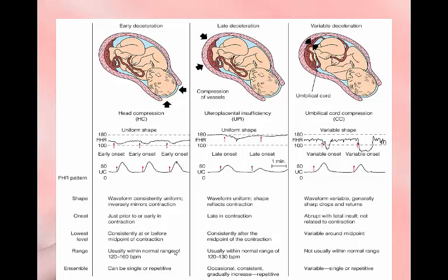Like I said, early decelerations are caused because of head compression. They are not worrisome. Okay, when we see early decelerations, we know it's a normal physiologic response. We don't need to do any other interventions. We just continue to assess and continue to monitor.